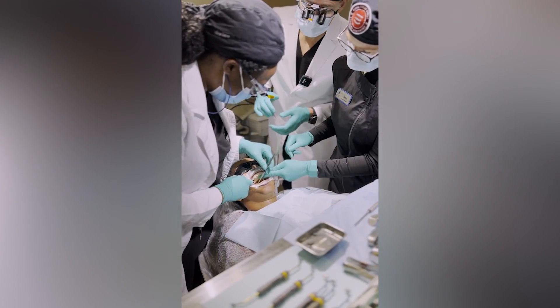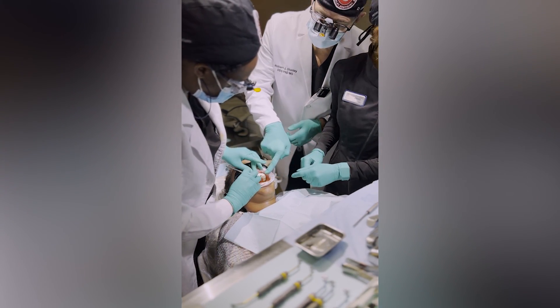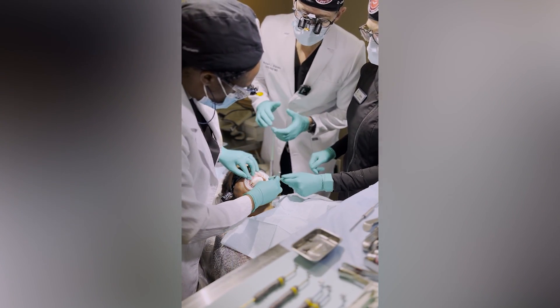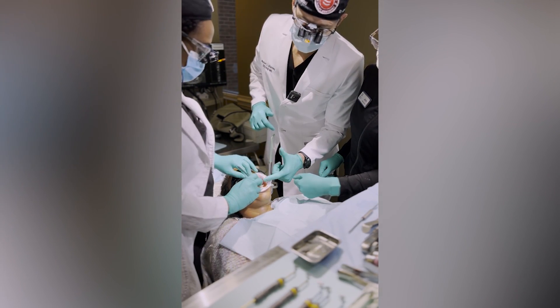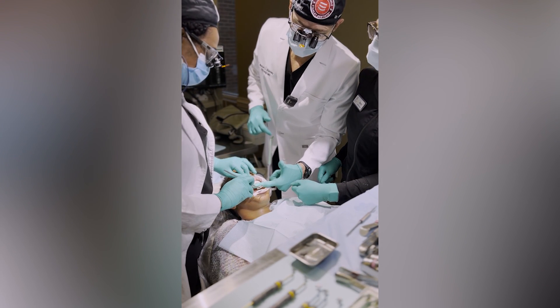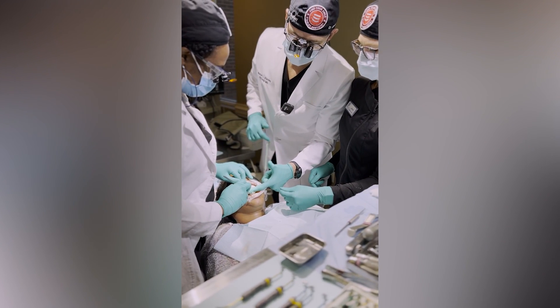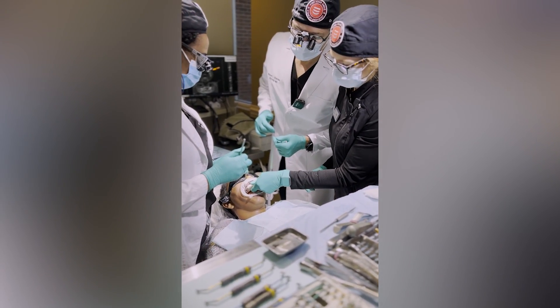Check the verification windows and just make sure that it looks like we're intimately adapted to the tooth. From my angle, it looks really good. When we build these guides, we like to build them with a flat plane right here so your assistant can hold that, or if you need to, put your finger and put a little pressure to keep it seated. A lot of labs will just make those as round rods, and that's no good. A flat plane across there is perfect — it doesn't affect the tongue or the breathing.